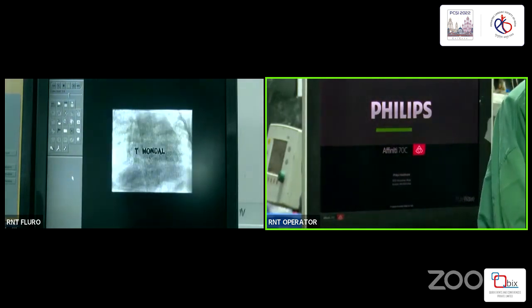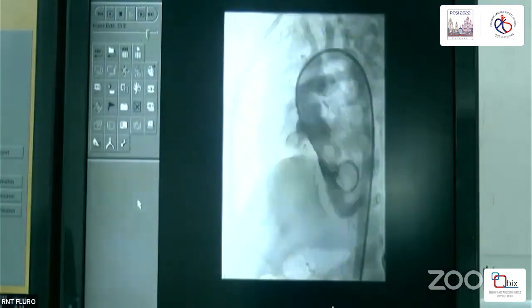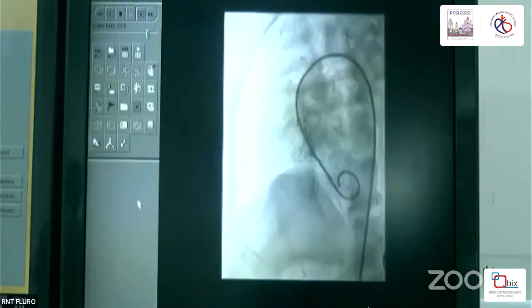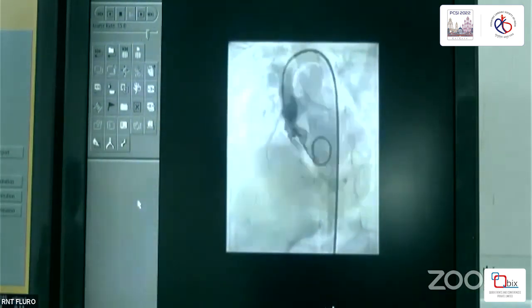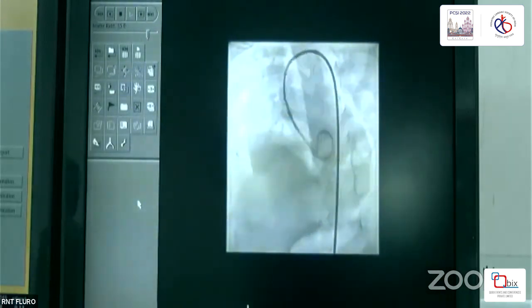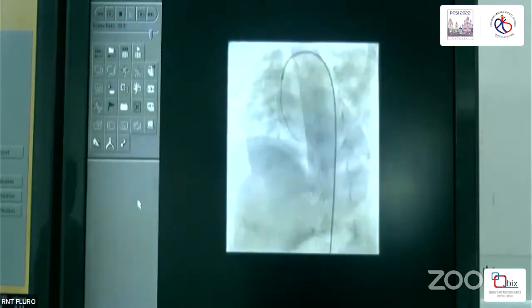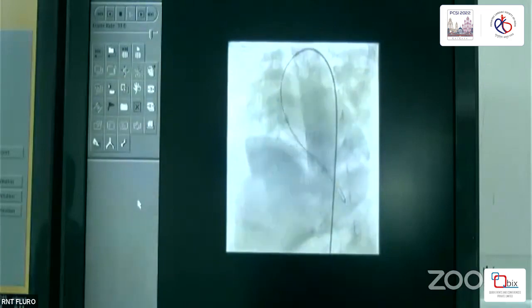Yeah, so go ahead. The 60 degree angio is showing a moderate size VSD, multiple jets on the RV side. We have also taken a 30 degree angio. According to the 30 degree angio, the RV side is showing only one shunt. So it's not well profiled. So right now our aim is to cross the VSD. So we have crossed the VSD from the aortic side. No, first tell us the size of the defect.